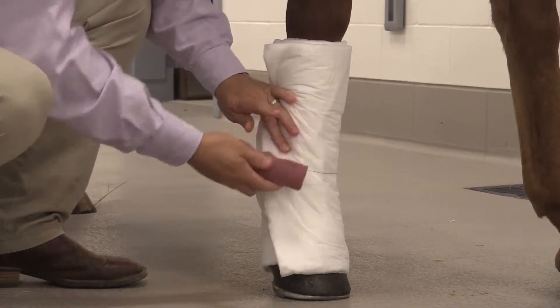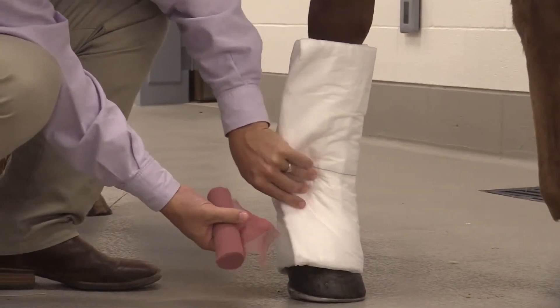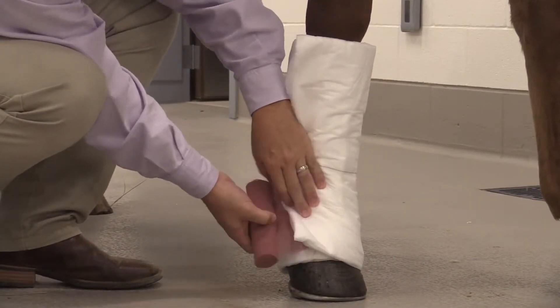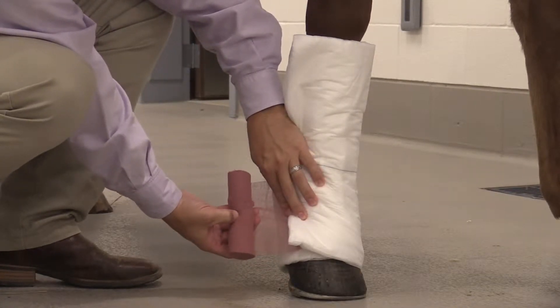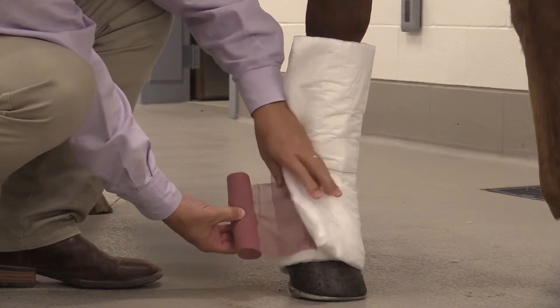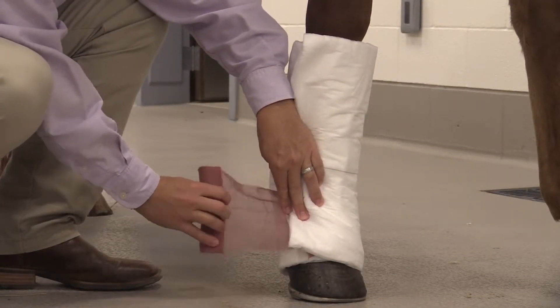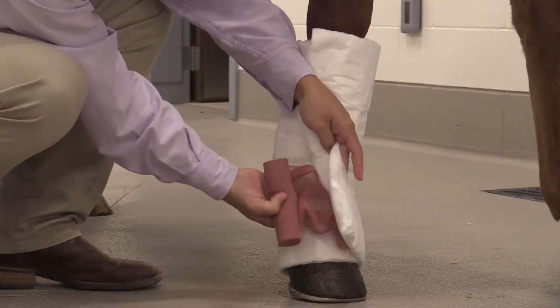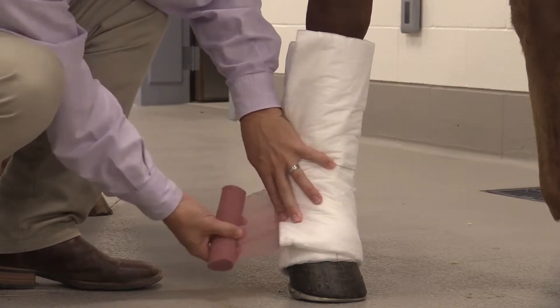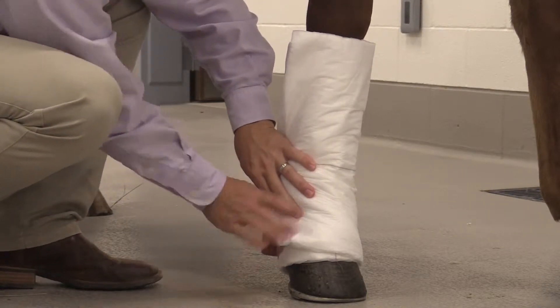To get this to hold in place, we will use brown gauze, going in the same direction. You can also see the way that we wrap it is so that the bandage material is closest to the wound and not opposite. The material needs to be rolling close to the wound and not away from the wound — that'll allow you to snug it on and place it in a secure manner.